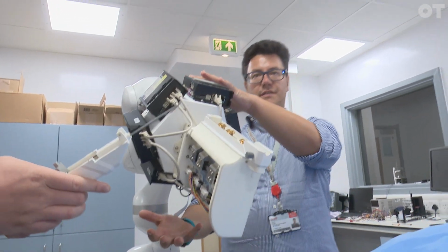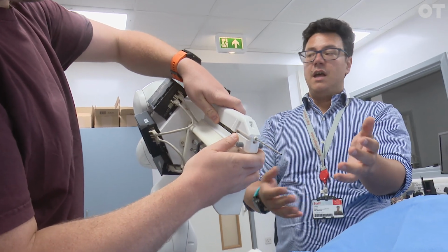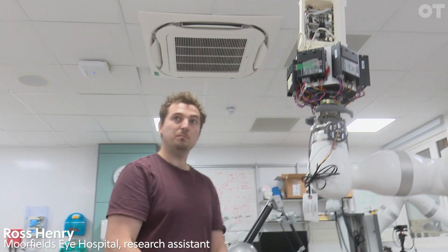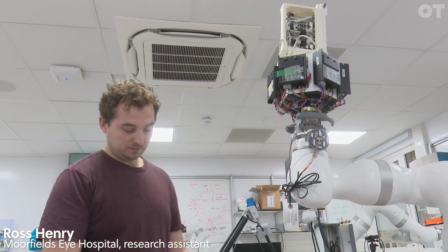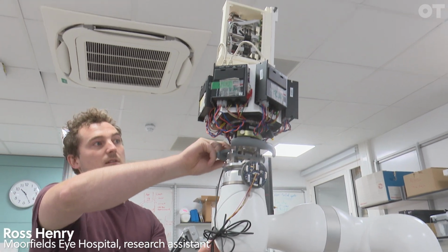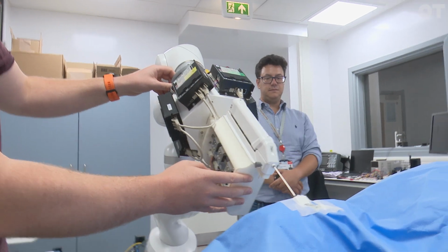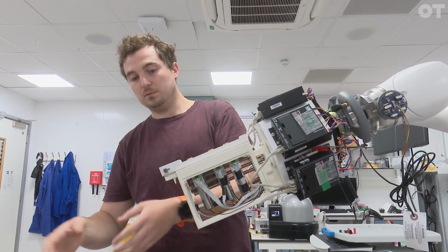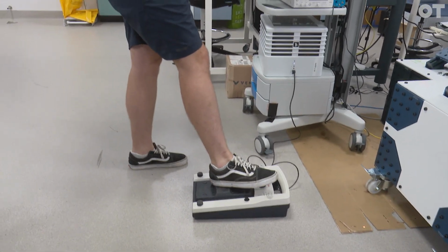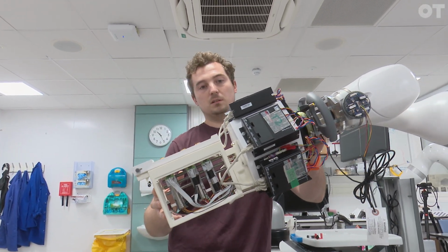You need something to hold this, which is still not that heavy, but you also need to take it into position. And that's hence the robotic arm. What we have is a standard microscope foot pedal, which we've taken and changed to do our own stuff. So for example, if I press this, it activates the hand guidance of this robot. Say there's a head here, you essentially just take it, bring it down to the eye, and then surgery happens. The surgeon will actually use this part of the foot pedal to control how we move the tip at the end, and whenever we're done, you just press this button again and bring it out.